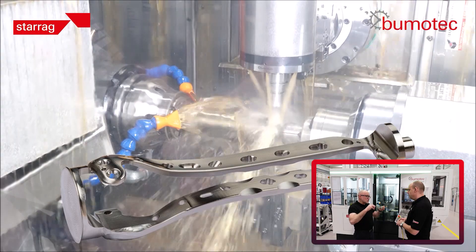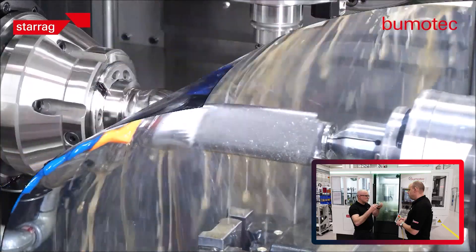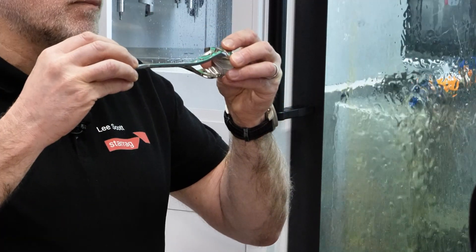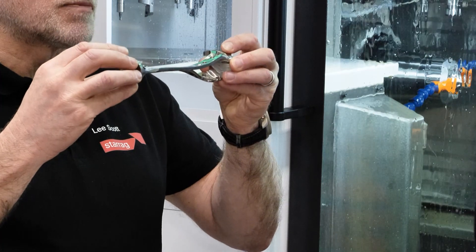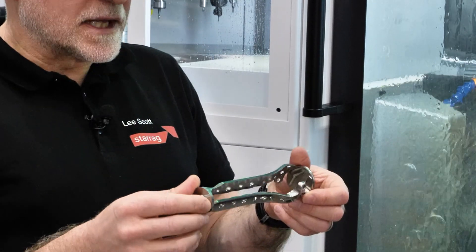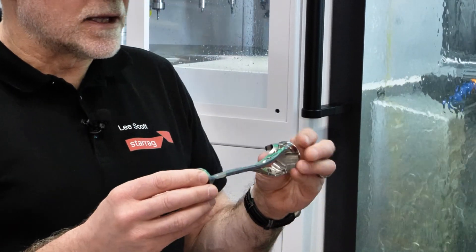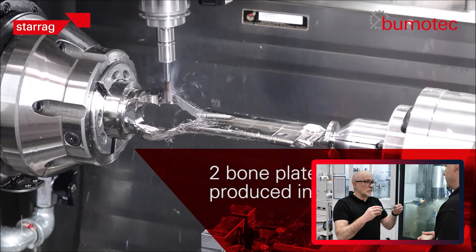Holding between centres, we then machine the rest of the component, but it's really important that we have synchronised drives and we hold the part throughout the whole process — otherwise if we let go it's just going to spring. And you might get chatter and vibration with a part like this when you're machining.